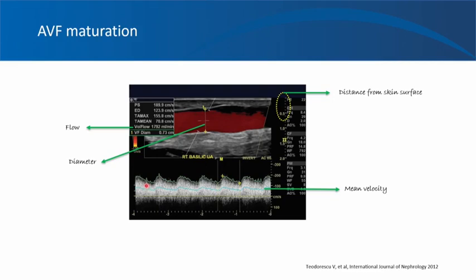And the machine is also giving you the graph, and it says that the peak systolic velocity is 189.9 centimeters per second and end diastolic velocity is 123.9 centimeters per second. And now this blue line is the average velocity the machine used to calculate the flow. And plugging into the previous formula, the machine will tell you what is the total volume flow.